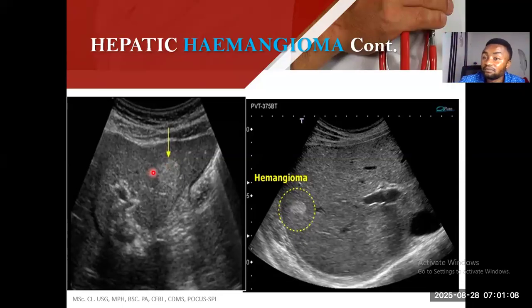After 60 years, sometimes the liver size will reduce. Or it could be that the person has reduced the zoom, the magnification. Yes, you can reduce it for it to appear smaller. That doesn't mean it will affect measurement. No, the zoom button doesn't affect measurement. So this is hemangioma over here.